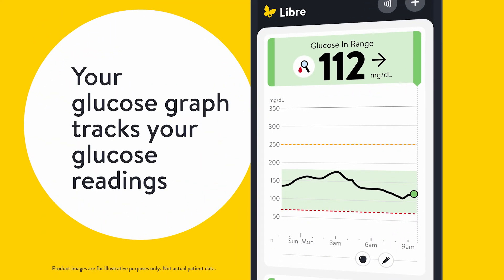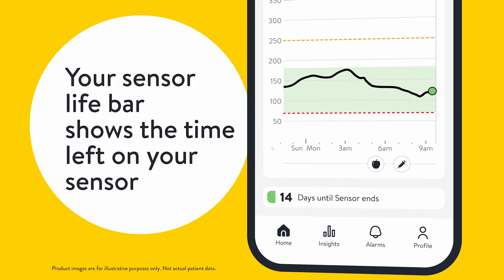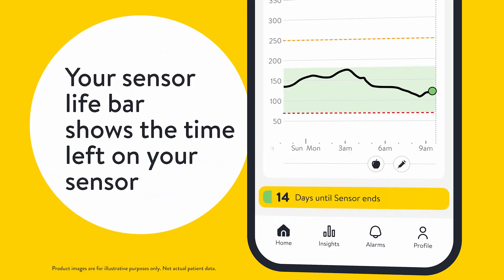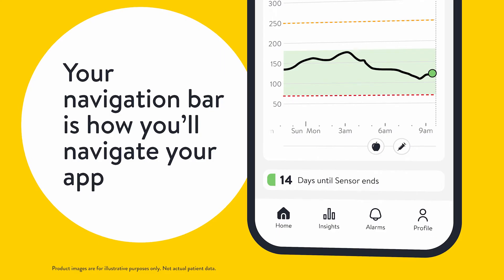Your glucose graph tracks glucose readings. These icons represent notes you've added. Your sensor life bar shows the time left on your sensor. Your navigation bar is how you'll navigate your app.